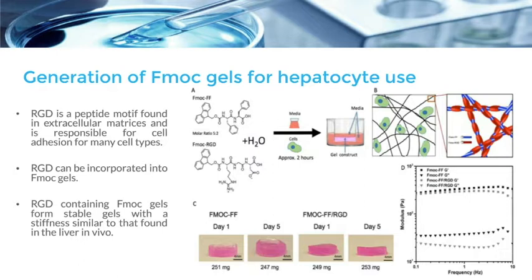As was mentioned by Mitch, there's a lot of both variability and reproducibility issues with doing this. The other problem is that natural hydrogels, such as Matrigel or collagen, don't readily recapitulate the elastic modulus or the stiffness that we find in vivo.